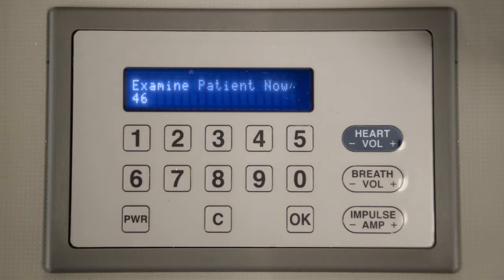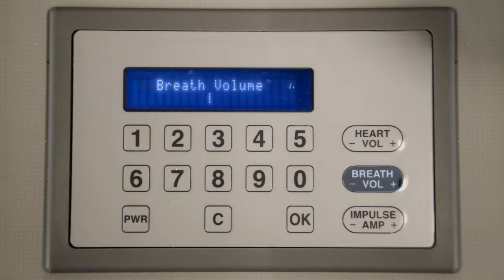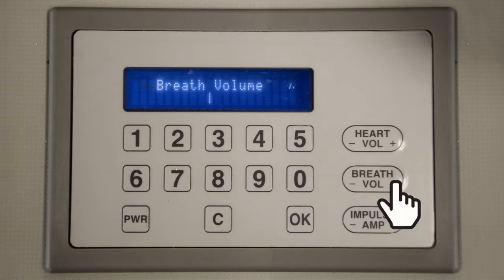The heart volume keys control the volume of both the stethoscope and infrared device. Change Harvey's volume by pressing the VOL plus or minus buttons. The breath keys control the volume of Harvey's breath sounds. You can adjust the volume by pressing the breath plus or minus buttons.